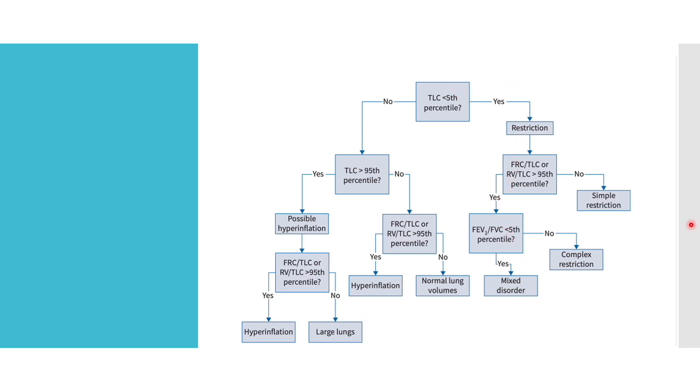If your FRC/TLC and your RV/TLC were normal, but your TLC was reduced, then we are sure that it is a simple restriction. Now coming to the other part: if your TLC is normal, we've ruled out restriction.